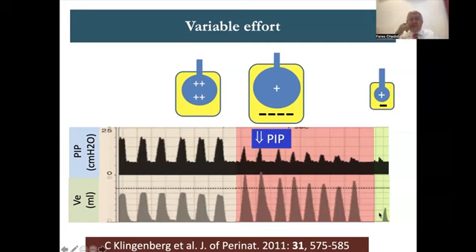So this is a variable effort where the patient initially had no effort, lots of effort, zero effort. So all of these affect the PIP.